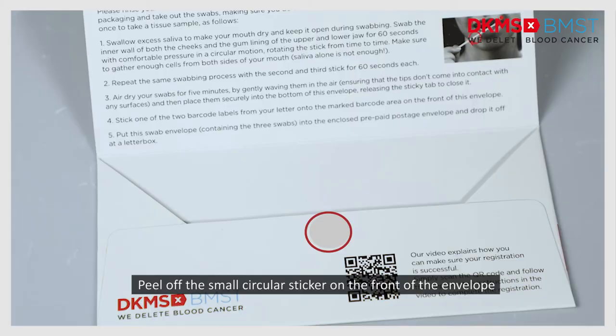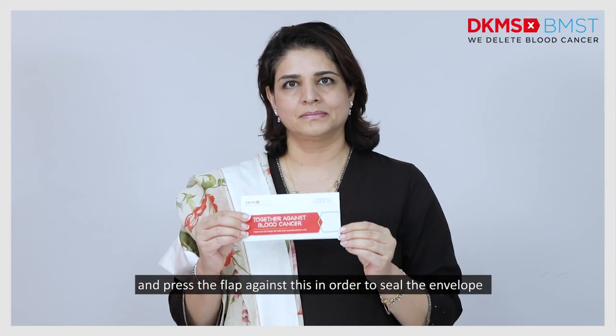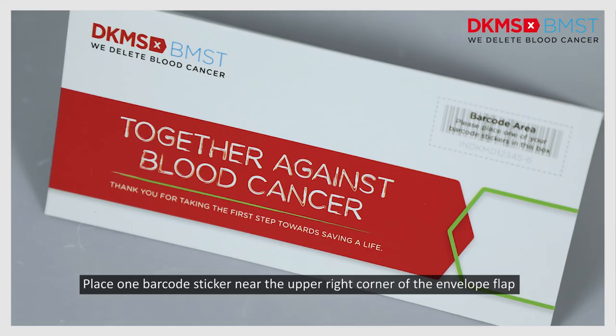Peel off the small circular sticker on the front of the envelope and press the flap against this in order to seal the envelope. Place one barcode sticker near the upper right corner of the envelope flap.